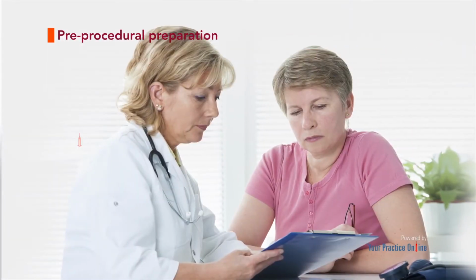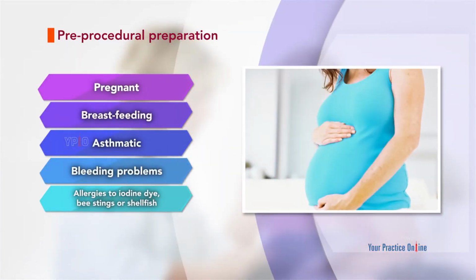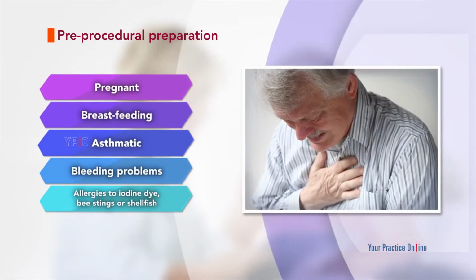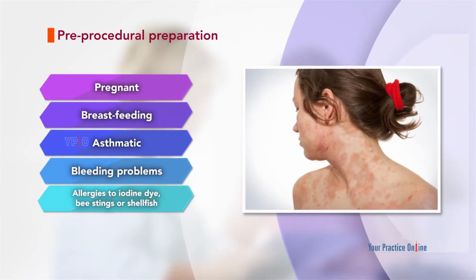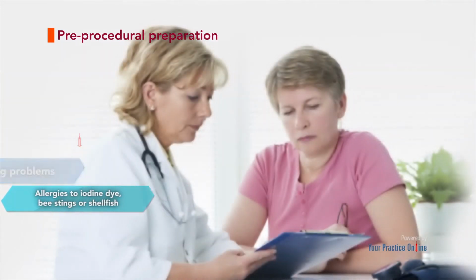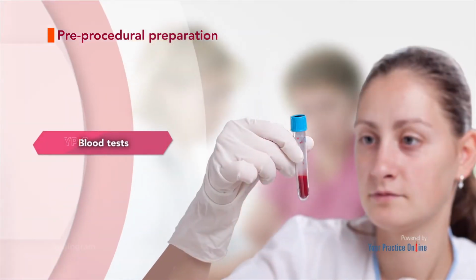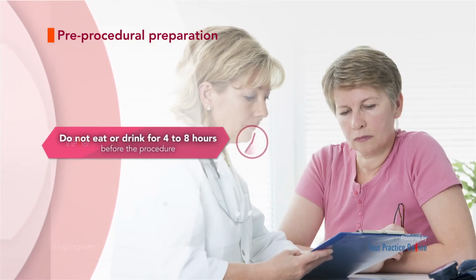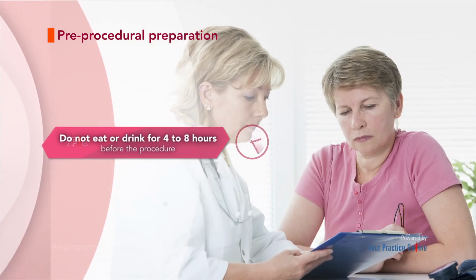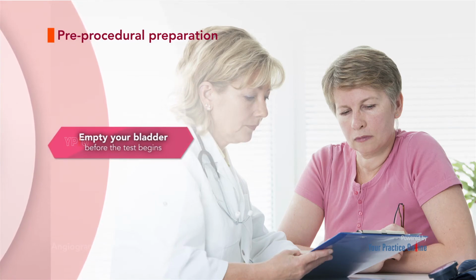Pre-procedural preparation. Before an angiogram, inform your doctor if you are pregnant, breastfeeding, asthmatic, have bleeding problems, or any allergies to iodine, dye, bee stings, or shellfish. Your doctor will ask you about the medicines you are taking and review your history. Your doctor may order certain blood tests and will advise you not to eat or drink for 4 to 8 hours before the procedure. You will be asked to empty your bladder before the test begins.